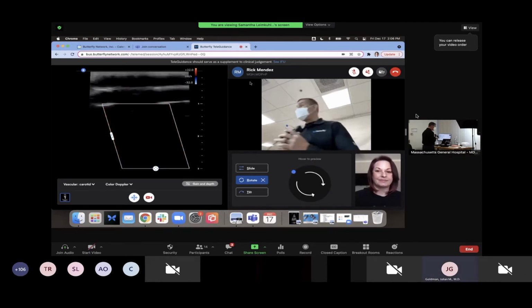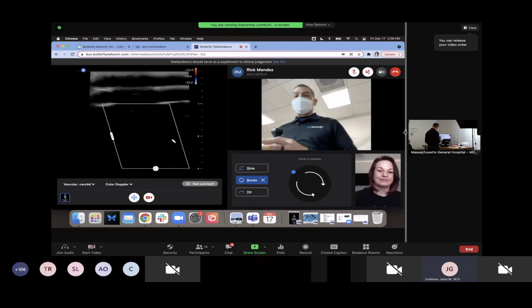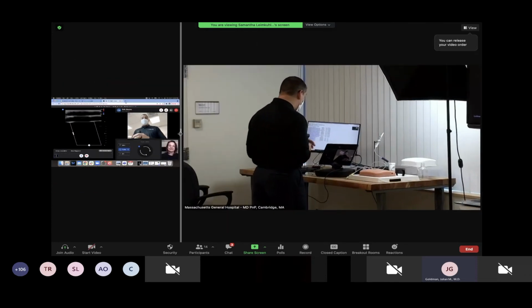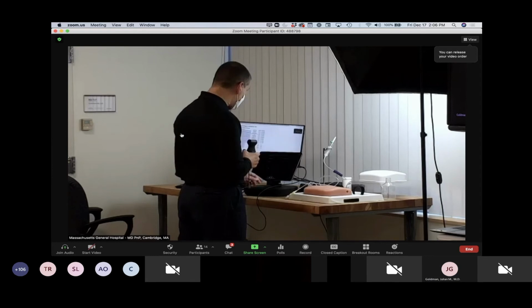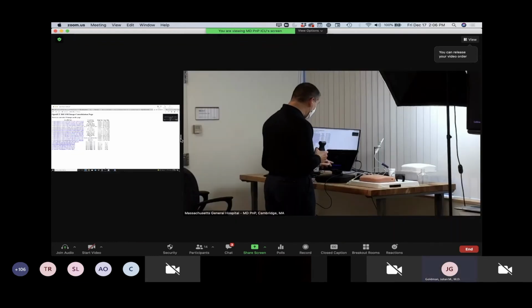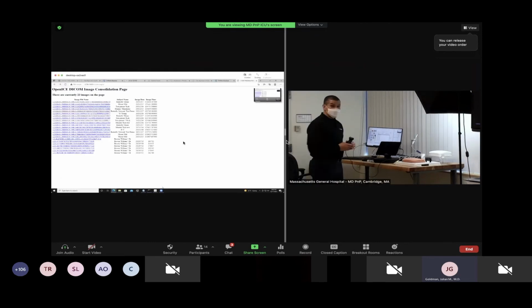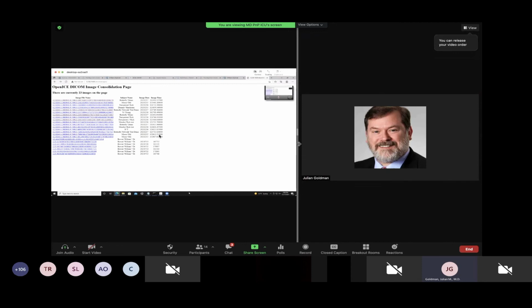Terrific. Thank you so much, Samantha. I'm going to go ahead and end the session and send that image up to the MGH PACS device so that they can review it. So thank you again. At this point, I'm going to send that image that we acquired directly to the MGH PACS for further review.